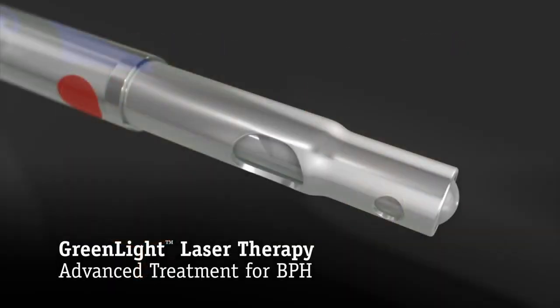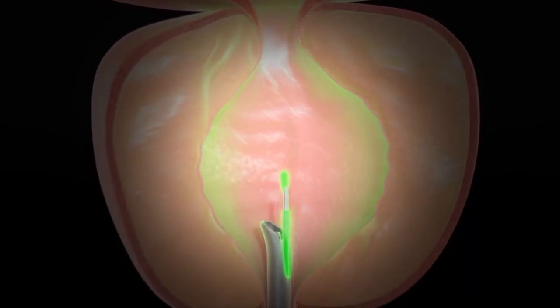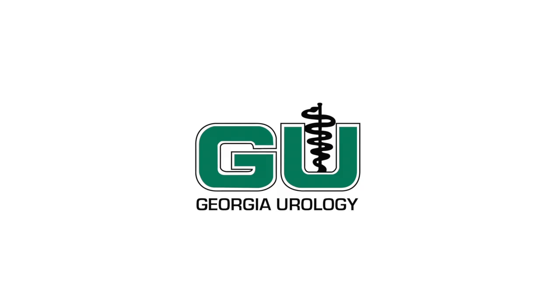Green light laser therapy is different than other laser therapies because the wavelength of the light is green. That green is absorbed by red, which obviously is the blood that's in the system, which allows us to do this in a very hemostatic way, meaning less bleeding than other types of procedures.